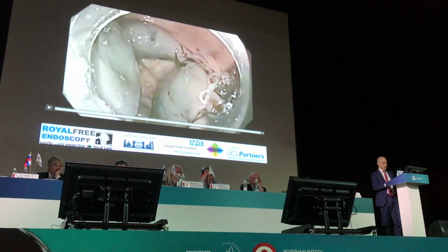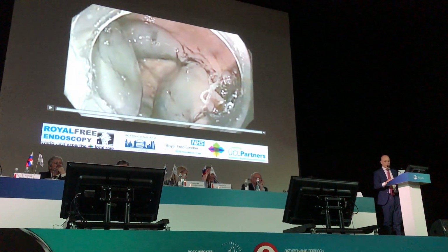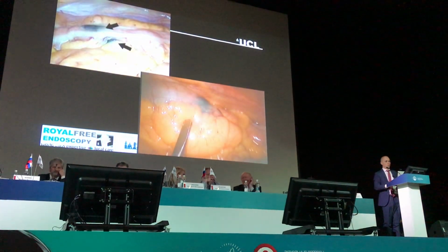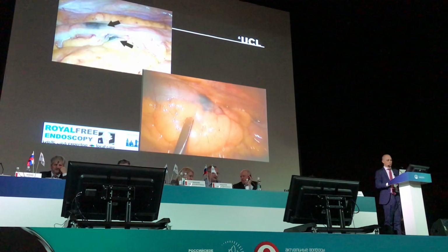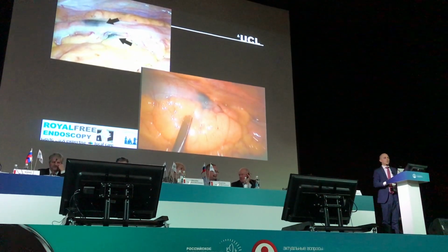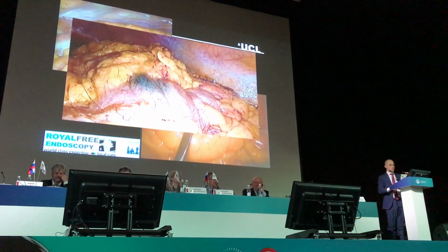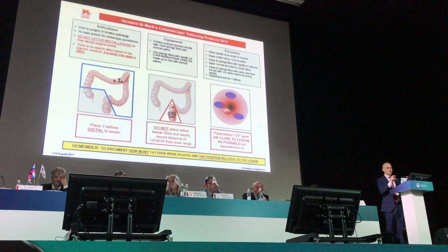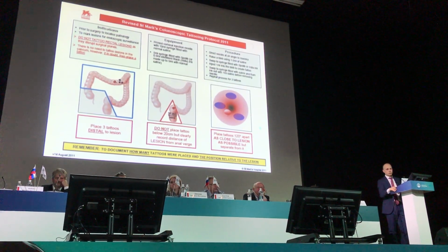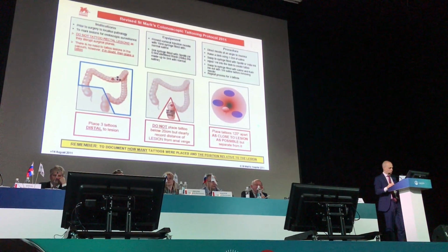As you can see here, you have 1, 2, 3 tattoos, and circumferentially, for the external part, it's very visible. This is what you want to achieve for your surgeon. Here there are 2 tattoos, here there is 1 tattoo. So it's quite visible, and quite nice for them to have this reference. And this is a protocol that was created at St. Mark's Hospital, which is a very important international hospital where I was a fellow almost 8 years ago.